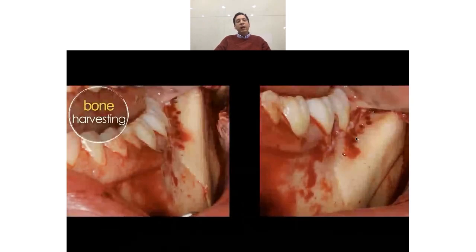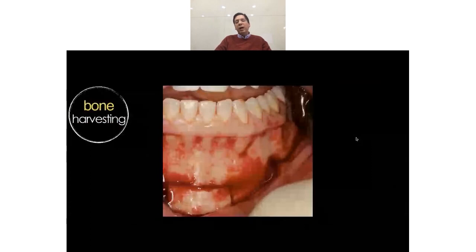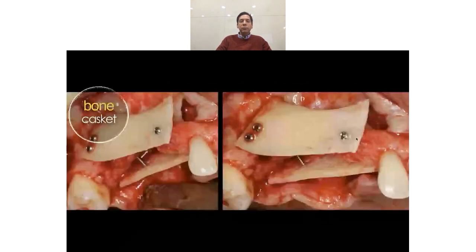Then we raise a flap in the mandible. This flap was made in order to harvest bone blocks. We harvest from the external oblique line of the left side of the mandible a big bone block, and then in the chin, a smaller bone block. And we split those blocks. So we place a big block in the buccal aspect and another big block in the palatal aspect. I always like to put the block in the palatal aspect because I want to seal the defect very well, very hermetically.